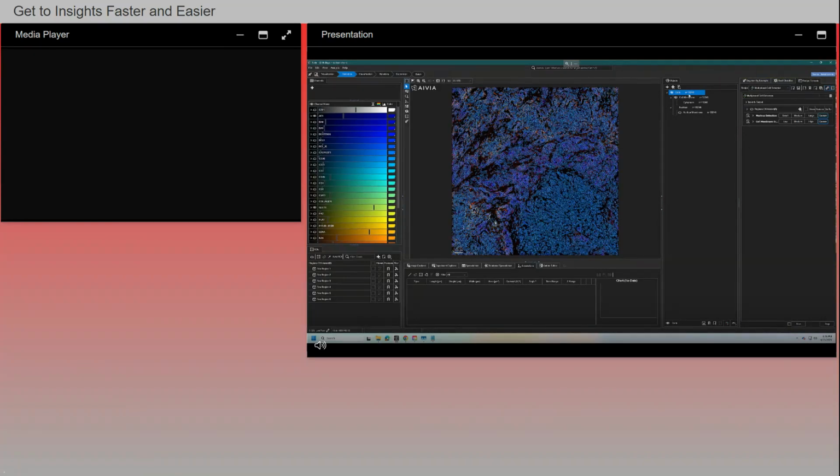So in this example, I have already detected 19,248 cells using a multiplex cell detection recipe where I've specified 8 different channels as input that are delineating the membrane or cytoplasmic area. And when I apply for this image, it takes a little under 2 minutes. In the interest of time, I've already run the analysis and generated measurements. So from here onwards, I want to show you how you can train a classifier or a classification step so that you can actually get insights about your images.